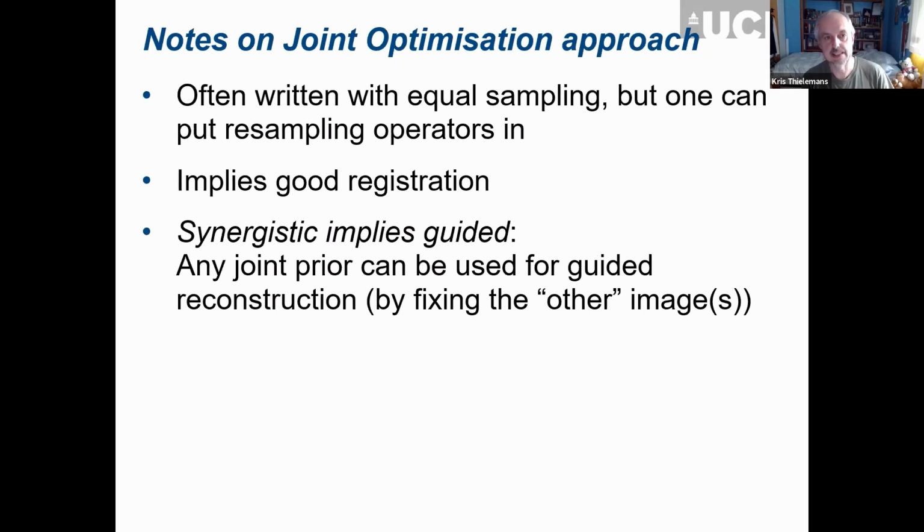And so in that sense, you have to think very carefully about the scale of the images. But clearly, you are 100% correct that it's actually the objective function itself and the sum of the objective functions that determines which directions you should be taking. Yes, and that is not an easy problem.